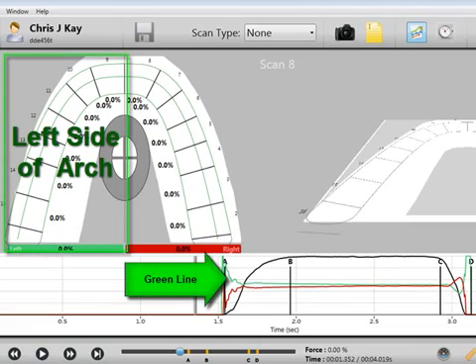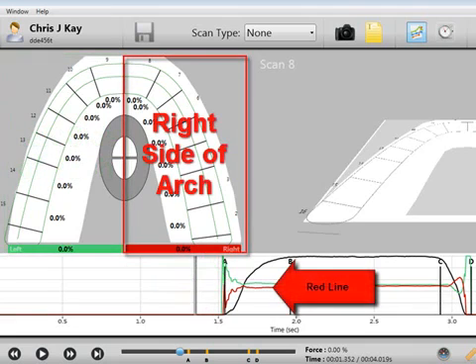The green line represents the left side of the arch, and the red line represents the right side of the arch.